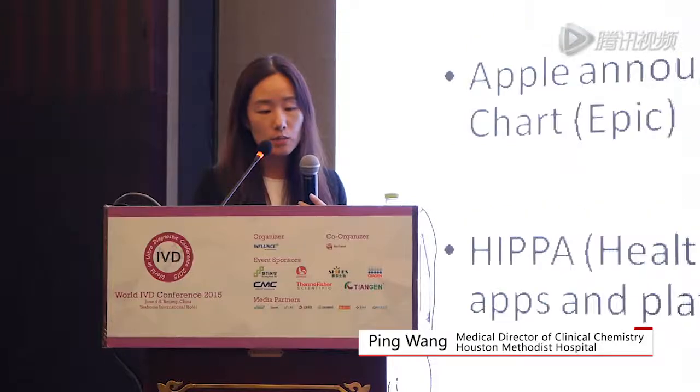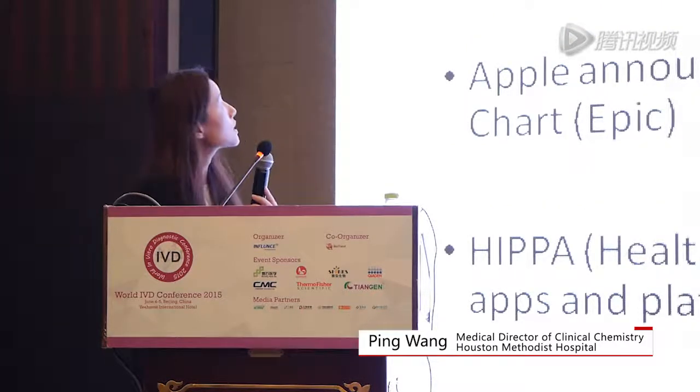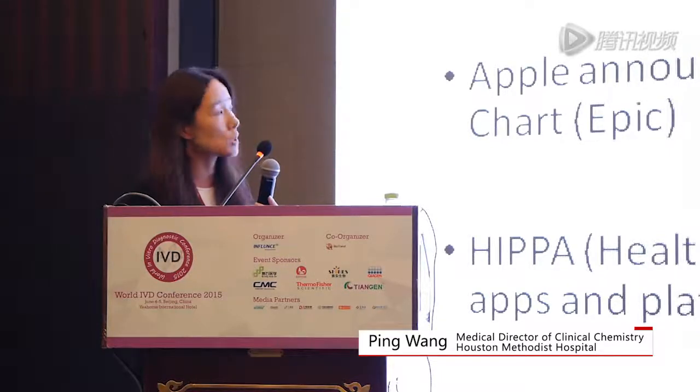And then, we have generated lots of data in a next generation point of care. What about the disposal of these data? What are we going to do with it? That brings me to the issue of data connectivity. In January of 2015, the US FDA actually approved the marketing of the first system of mobile medical apps for continuous glucose monitoring data sharing. That's a very long sentence, I apologize for that.